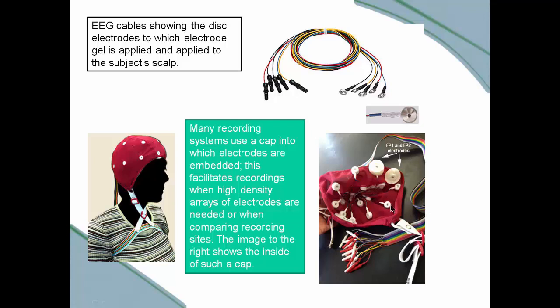electrode gel into these. I think that I've got on your agenda in the next couple of weeks or three weeks, even a video of how the gel is introduced into these. We're not going to do that either, but again, this is something that you need to know in order to do real EEG. We're doing real EEG with this course, but I'm talking about the more advanced version where you can do some exciting research as well.